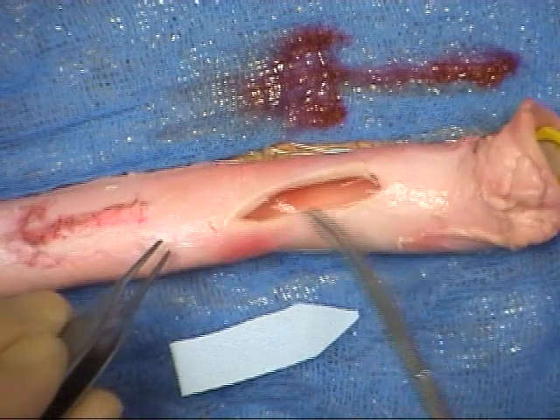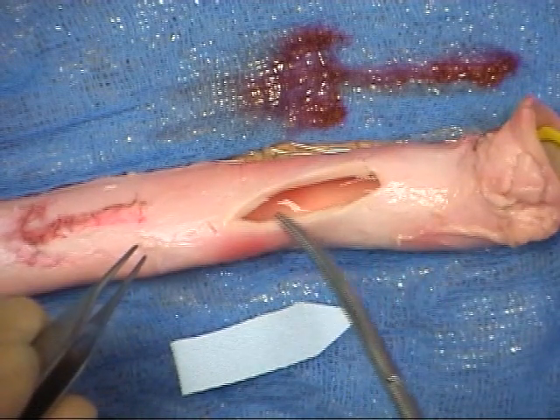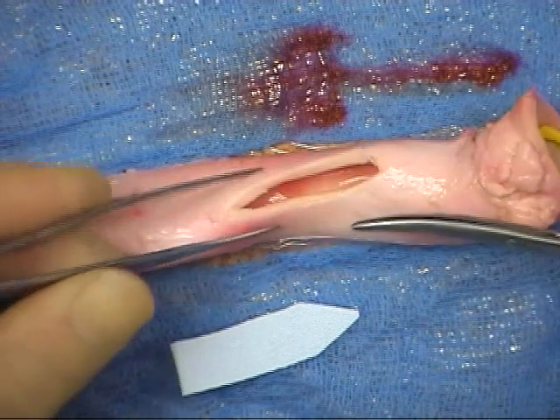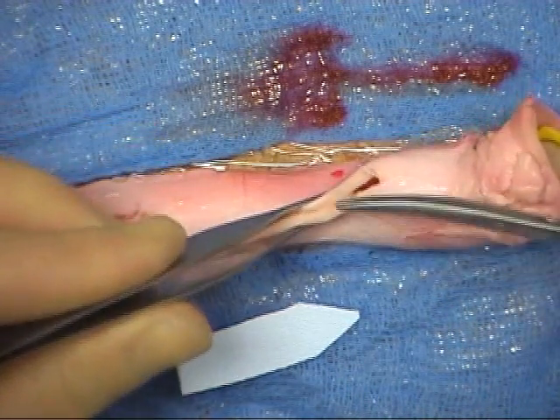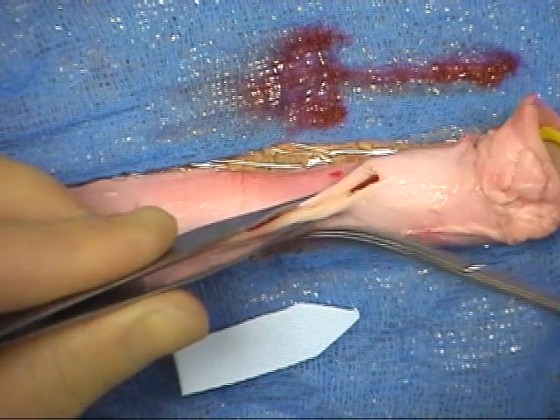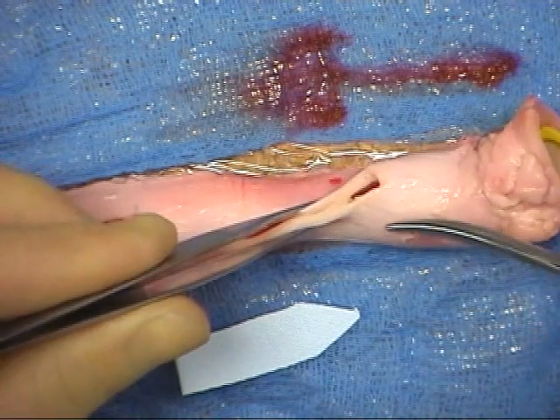In this demonstration, a graft will be sutured onto an elliptical opening in a section of porcine aorta. A primary closure of this ellipse would result in significant narrowing of the diameter of the vessel. A synthetic patch will therefore be used to close the opening.